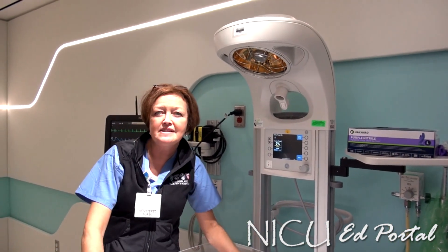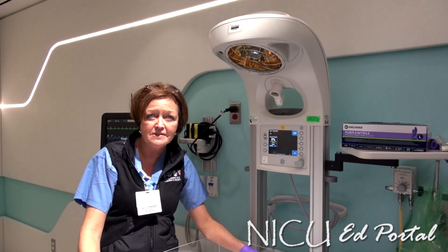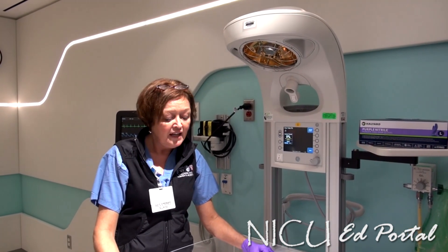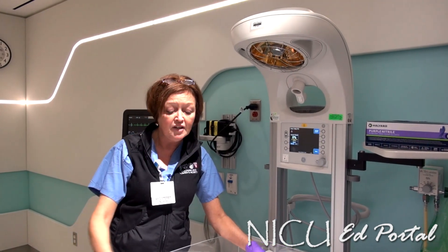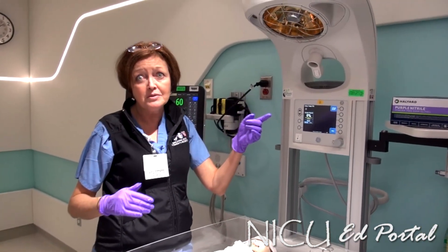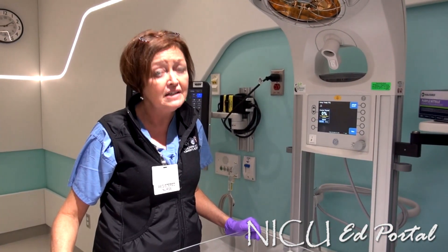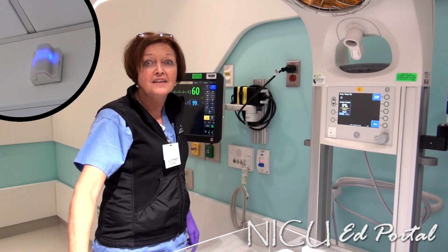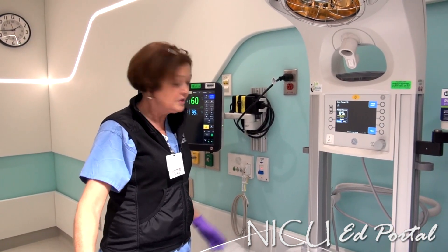For every intubated baby that comes to the NICU MRI suite, we will have a physician, a respiratory therapist, a nurse, and a radiology technician present for the entire procedure. If there is an emergency, the baby can be brought out of the scanner quickly and brought to the warming table where all emergency equipment is located. There is also a telephone on the wall, but if the team needs additional backup, you hit this Code Blue button and you will get full support from outside.